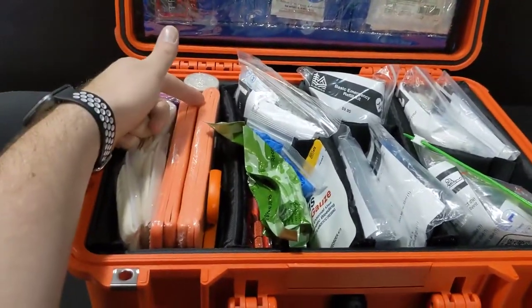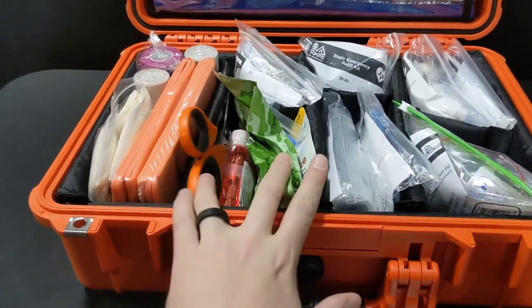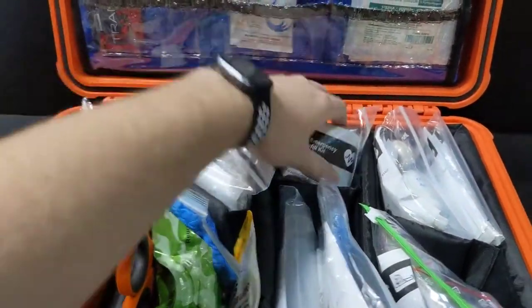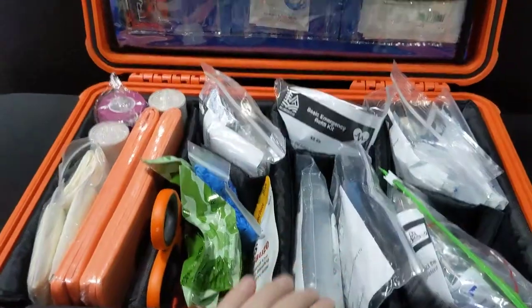We've added some items to show the organization capabilities. There are Sam splints, a full pair of X shears, and all your splinting goods. We've set this up as a stop-the-bleed area with a tourniquet, pressure bandage, quick clot, and gloves. We've also added medical modules, keeping everything nice, organized, easy to view, and easy to pull out what you need.